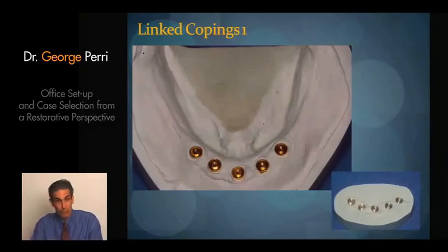We can also have a proof, an index of that registration, so that we can evaluate how they developed our master model and make sure that it's accurate. It took a long time to talk about this technique, but if you evaluated chairside time, it was actually quite minimal. There was only a very short amount of chairside time, less than an hour, to generate a full arch model that you're 100% confident will give you an accurate final restoration.